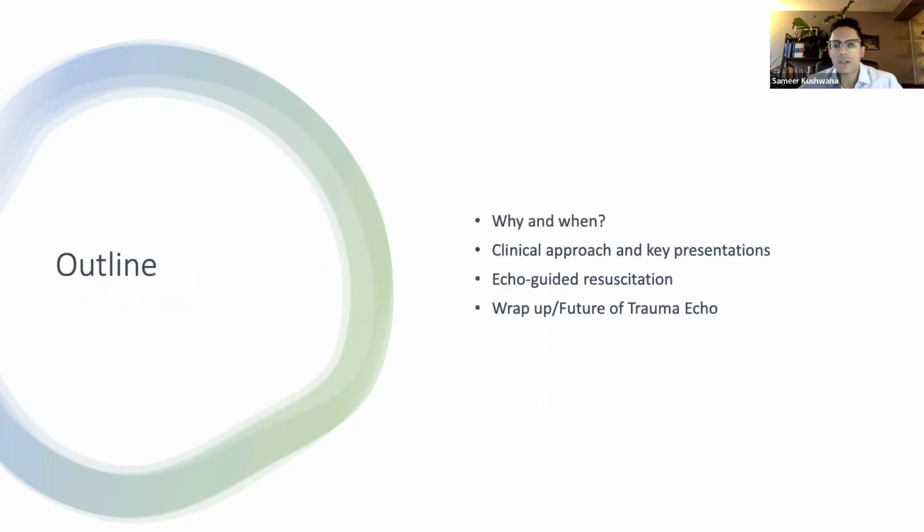So during this presentation, I'll talk a little bit about the why and the when of echo use in trauma situations. We'll go over a clinical approach to assessing the trauma patient and various important cardiac presentations of people coming in with trauma. I'll go over echo-guided resuscitation, and then we'll finish just with a brief mention about the future of echo in trauma.